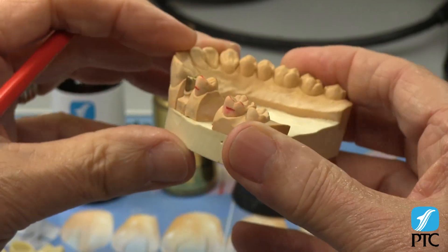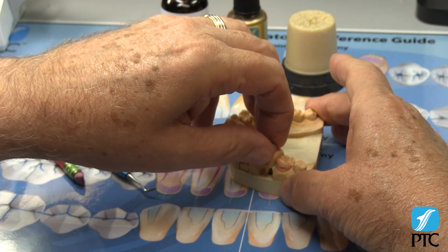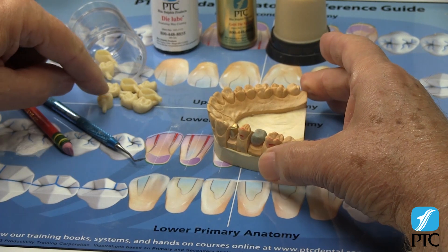We are showing the crown forms being placed over a dipped wax coping, but the exact same technique would be used if placing the form over a zirconia coping. The proper crown form has been previously chosen for the upper right molar.